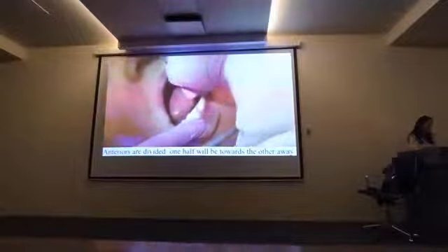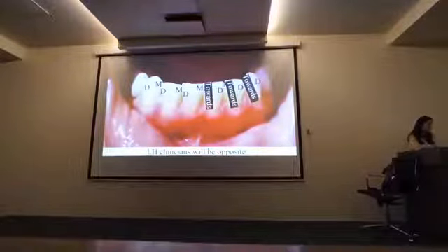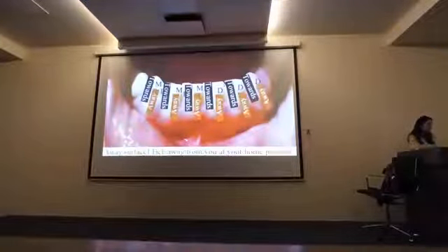For anterior surfaces, the tooth is divided in half, and the towards surfaces are the ones that are closest to me in 9. So for example, here on 22, I draw an imaginary line down the tooth, and the mesial is closest to me. Thus, it's my towards surface. This will continue on 23 and 24, the mesial surfaces. But on 25, 26, and 27, the towards surface is the distal surface. Once again, when I'm cleaning a towards surface, I will sit at 9 o'clock.